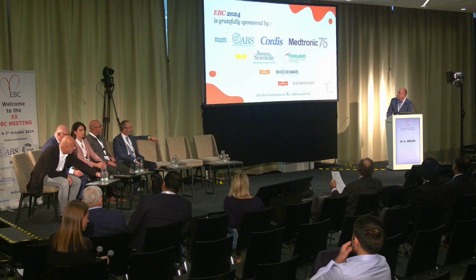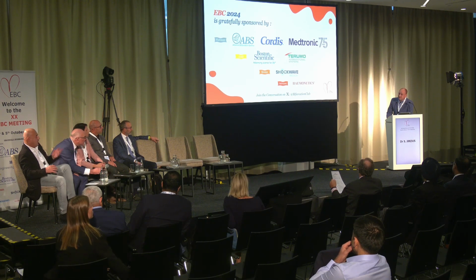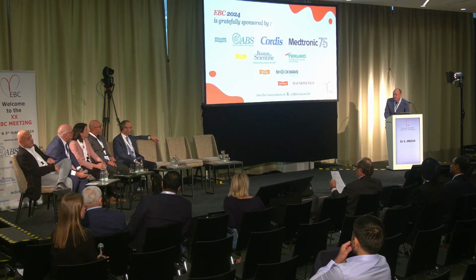Compliments. I think the same, and another point is that he was 86 years old in the second procedure, so we decided this way. Another key point is to use imaging in these cases. Yeah, this is really the case where we have to apply imaging technique before we decide what to do.